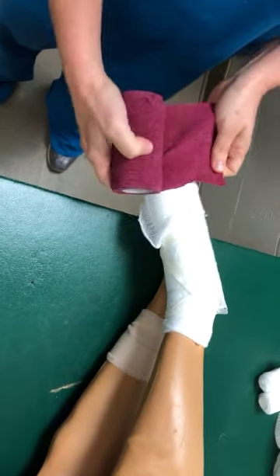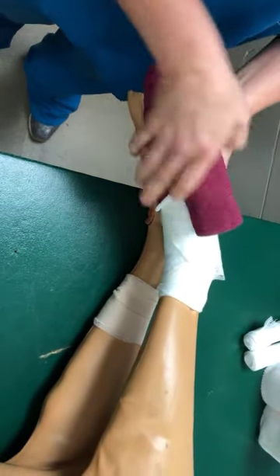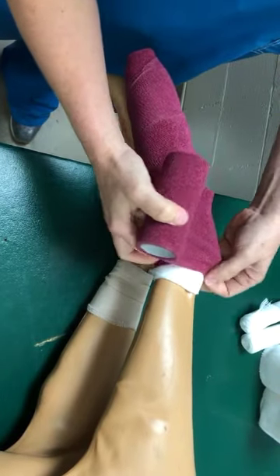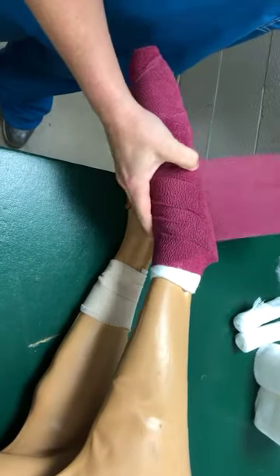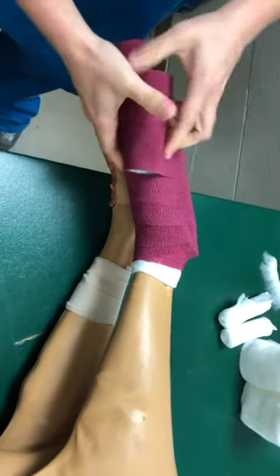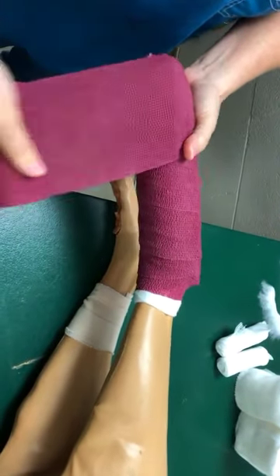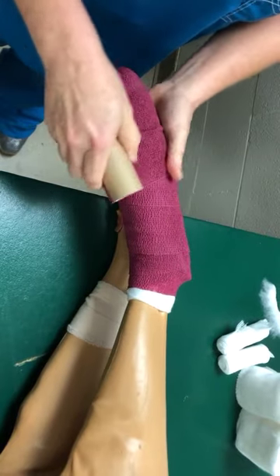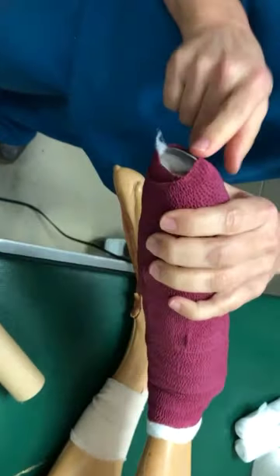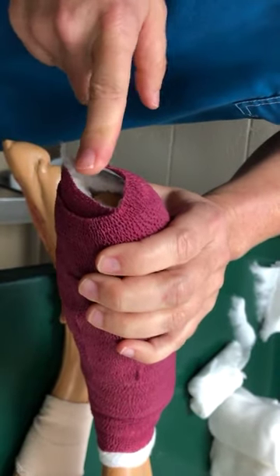Our last layer is our vet wrap. This is to help our padding stay clean. We need just a little bit of tension on this — small animals are a little bit different than large animals here, so we'll kind of lay this on gently. Come over the top and back down so we have that little support. I like to make sure I get a little bit of either the vet wrap or elastic tape on the bottom of the metal splint. That way when they step down on it, it's not as slippery.